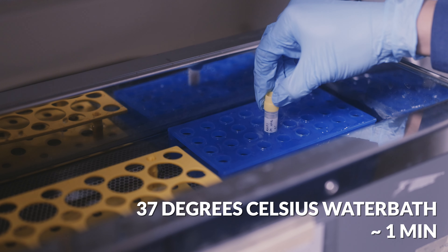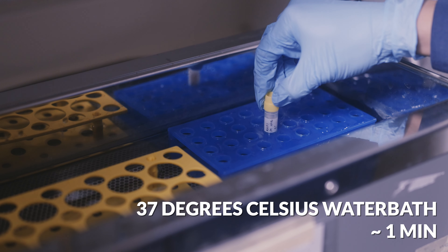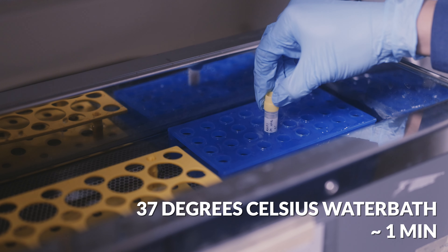Take the vial out of the hood and into a 37°C water bath for about one minute to thaw the cells. Do not fully submerge the vial in the water bath — use a floating rack to do this. Because you took the vial out of the hood, you need to spray it with 70% ethanol again.